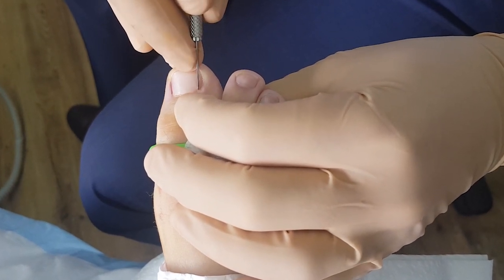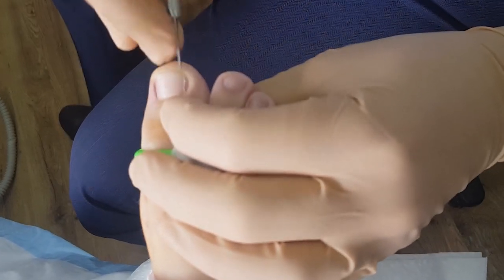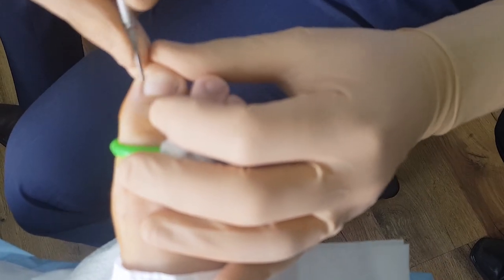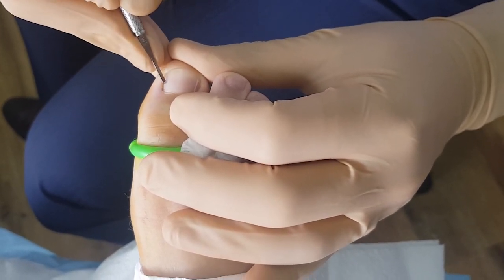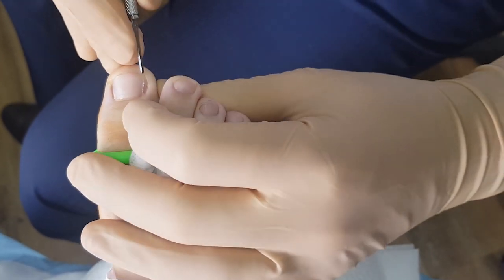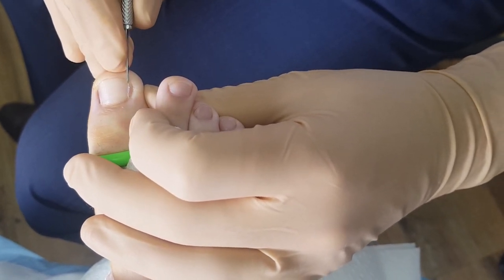Why don't you use the Thwaites? Because the Thwaites — it's got one side that elevates the nail, and it's going to elevate the good portion of nail. If we elevate the good portion of nail, then when we apply the phenol we can get underneath that, and then you'll get lysis occurring and the nail can start to lift.